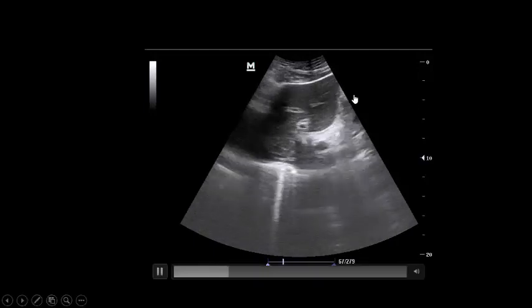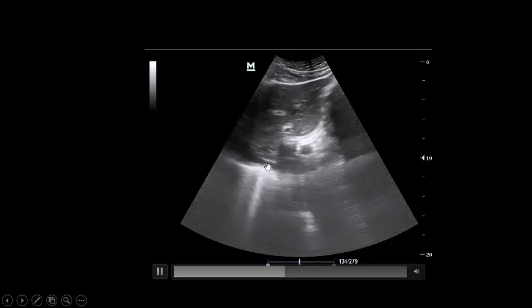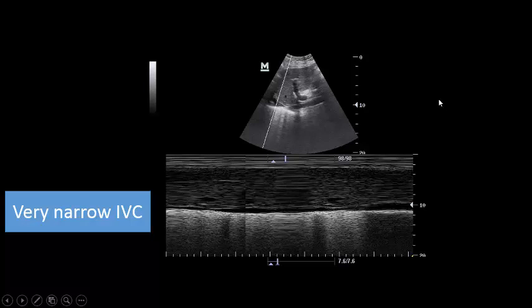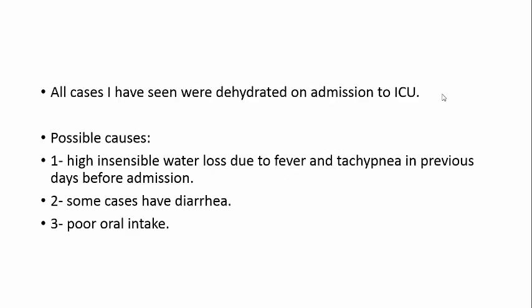First, inferior vena cava. As you see here, the patient's IVC is very narrow and totally collapsing. Attention: all cases I have seen were dehydrated on admission to ICU. Possible causes include high insensible water loss due to fever and tachypnea in previous days, some cases have diarrhea, and poor oral intake. Almost all patients I've seen on admission to ICU were significantly dehydrated, and I believe this is a main factor for acute renal failure.